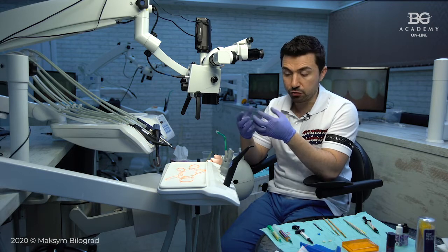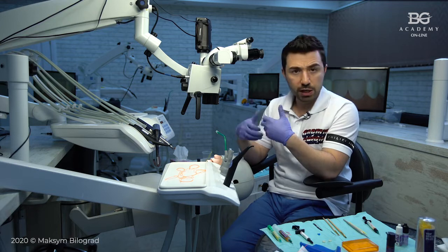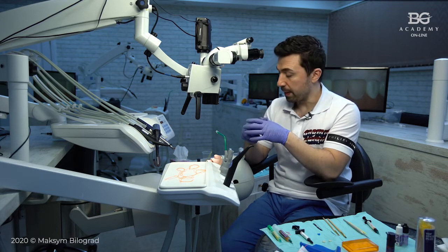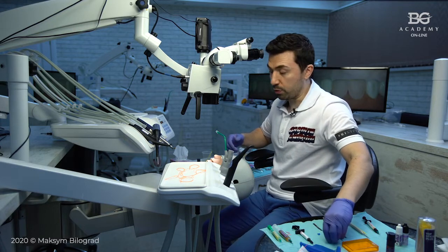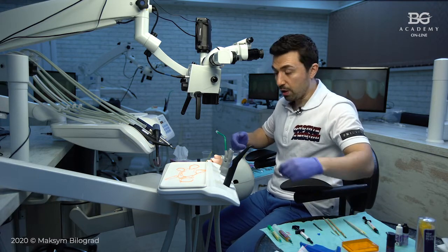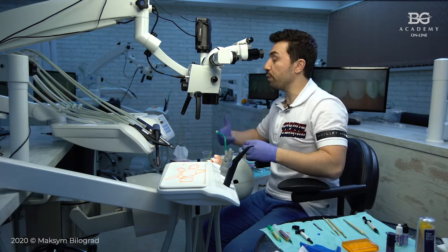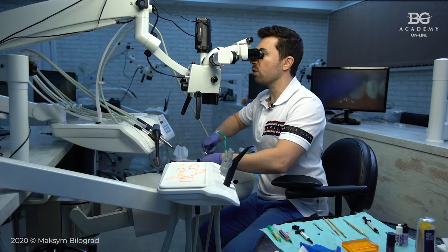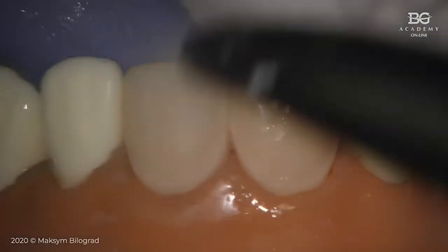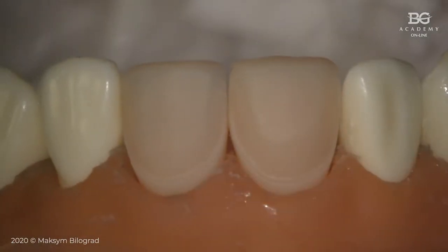a glycerin, the transparent glycerin gel or gel for sonography, for example, and you can make a try-in of ceramic veneers. Let me just show you how we make some try-ins and what parts of try-in are important to pay your attention to. Let me just remove this color from articulator paper. Okay, good. So now we will do try-in.